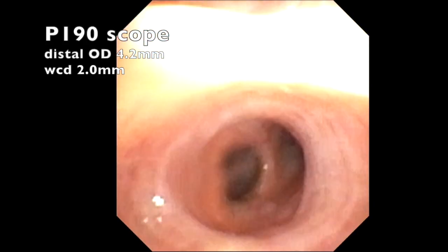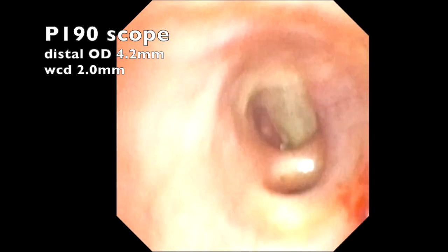A pediatric flexible bronchoscope is then used to survey the endobronchial tree. The small outer diameter of a P190 scope provides access to more distal airways while maintaining the ability to use other instruments through its 2.0 mm working channel.